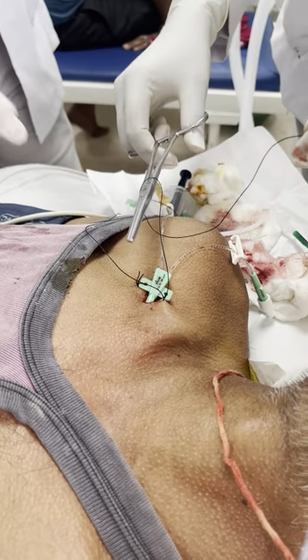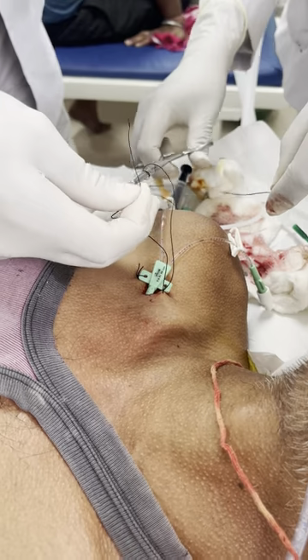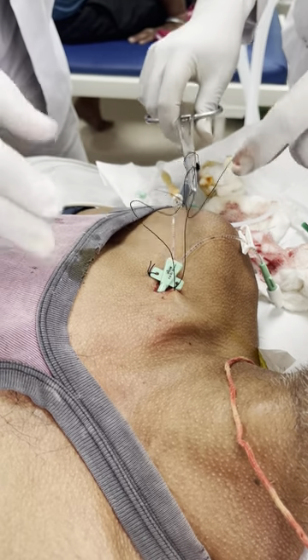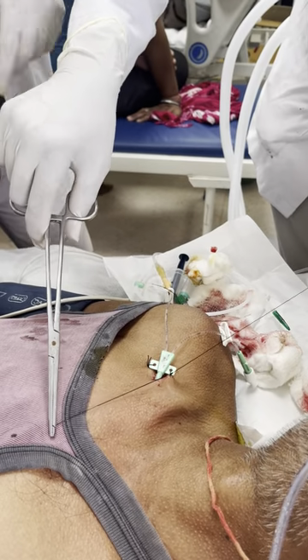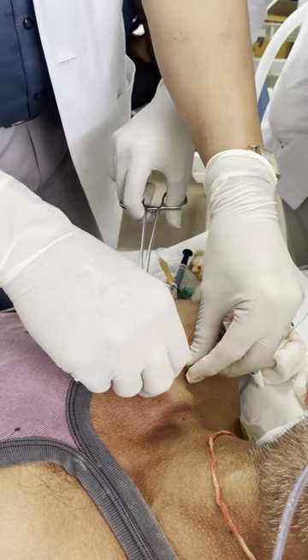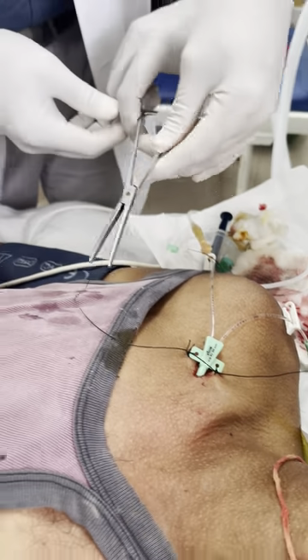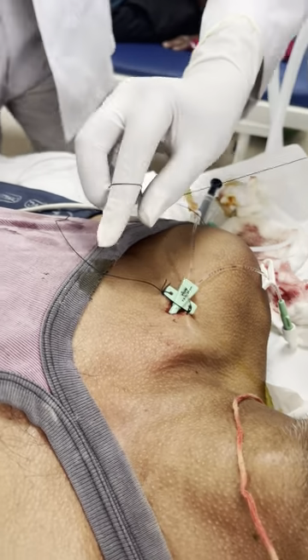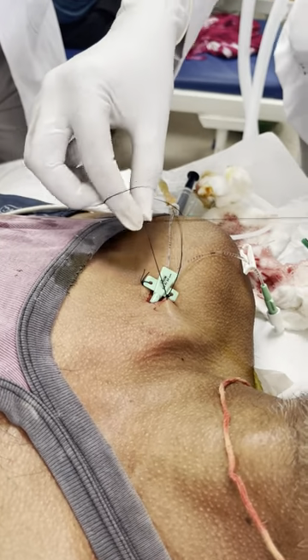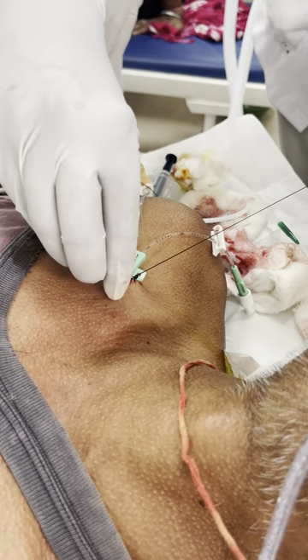One or two is enough. Good, good. After first, even one circle will do. Now, no, this is not enough. You have to tighten it. Now do it by hand. Okay? Do the same job by your hand. Good. Very good.